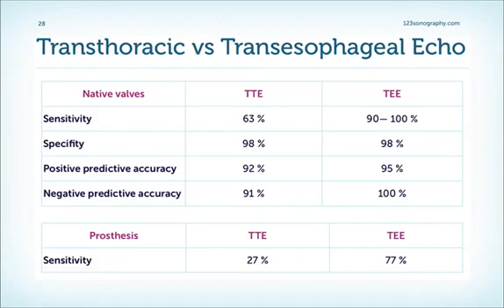And how does transthoracic echocardiography compare to transoesophageal echo? Well, if you look at the literature, TE is obviously superior. We have a very high sensitivity and specificity for TE, which is not as good for the transthoracic approach. In reality, however, and with improvements in 2D imaging and transthoracic imaging, the gap between TE and transthoracic echo is probably not as big as it seems here from this diagram. In many patients, you will be able to make the diagnosis with transthoracic echo. Where transthoracic echo is truly inferior is in the setting of prosthetic valves. We talked about that issue already in the appropriate chapter.